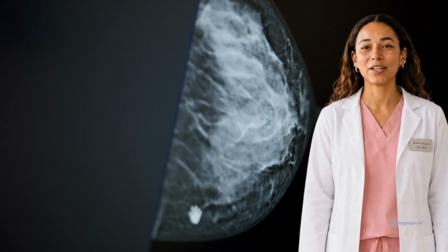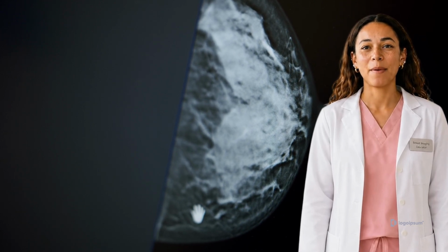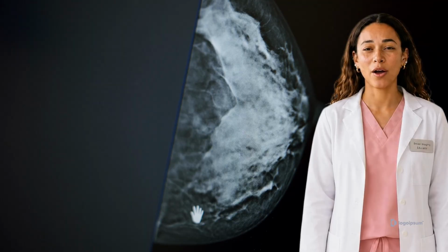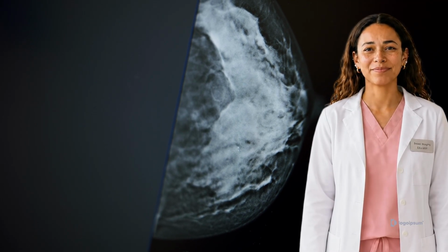For patients, having a 3D mammogram feels almost identical to a traditional 2D mammogram. The positioning and compression paddle feel the same, but as you hold still for a few seconds, the X-ray arm sweeps smoothly in a short arc over your breast. It takes a series of low-dose pictures from multiple angles, allowing us to build a detailed 3D image.